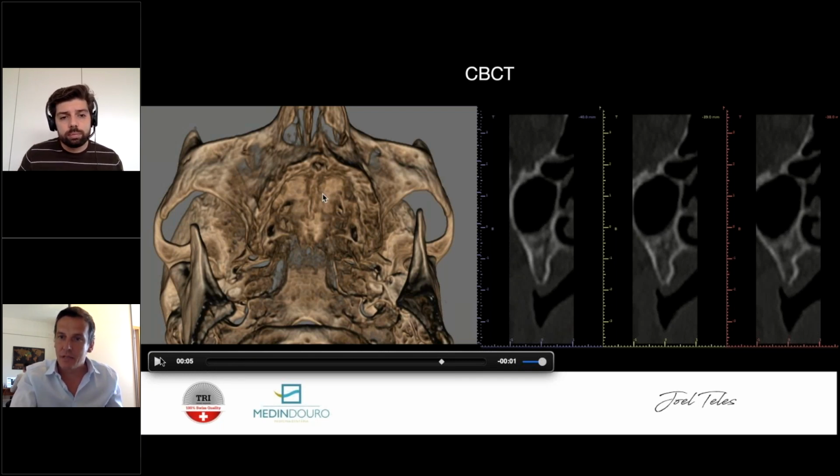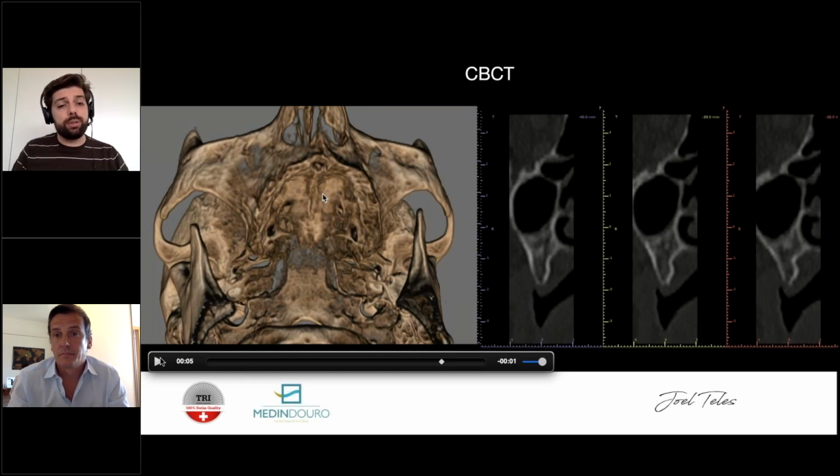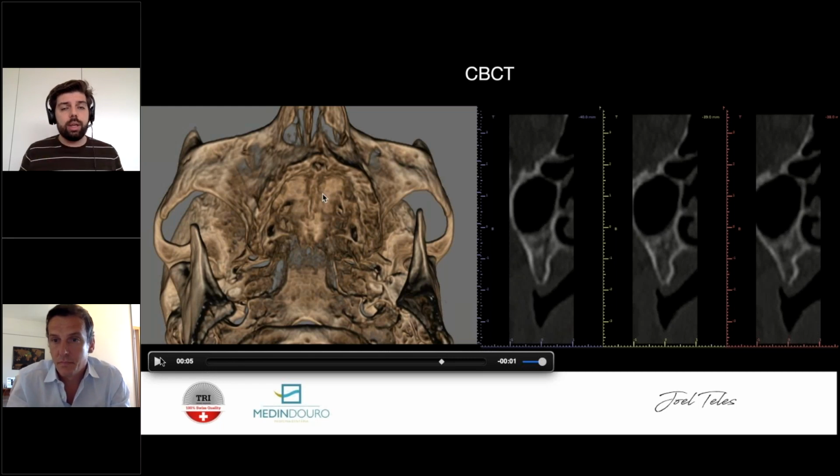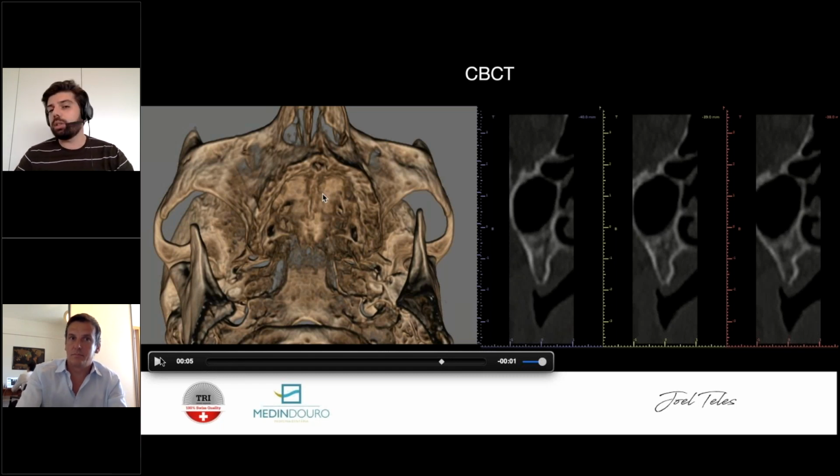And Dr. Salman from Saudi Arabia and Sajir Macrophotography are asking about a split crest. What about a split crest to create more bone? Good question. If this was a scenario in which I was dealing with a small bridge in a small portion, I would do split crest, because the ridge is very triangular in shape, so it's perfect for split crest. But if we're dealing with immediate loading, full arch approaches, there are better ways of approaching these. I would not go split crest, because it might lead to two problems.